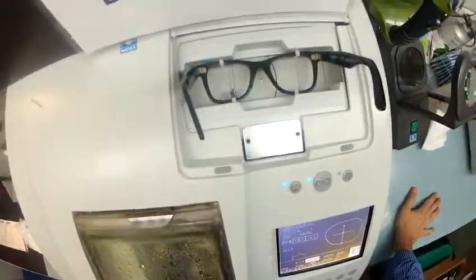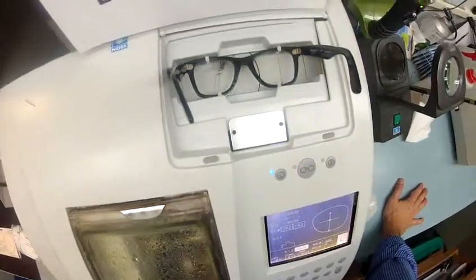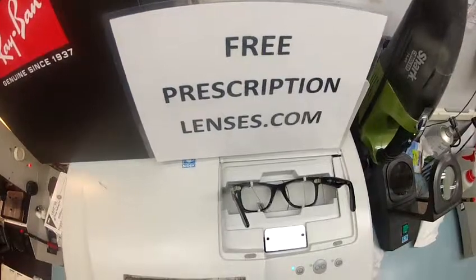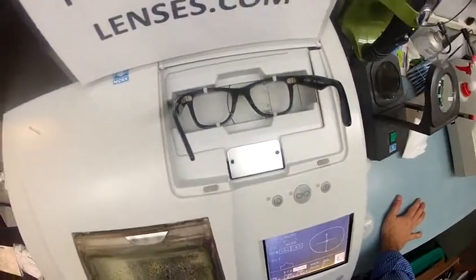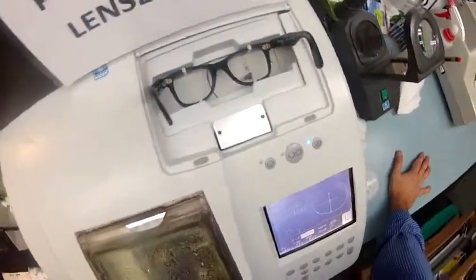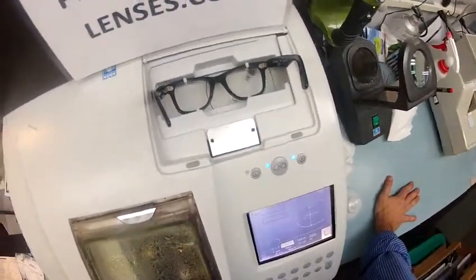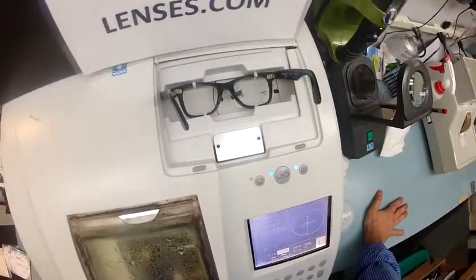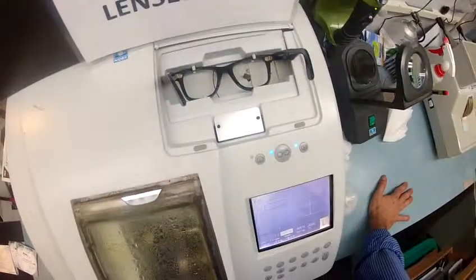The stylus is going to pop up and trace the shape of the left lens first, and then it's going to move over and trace the shape of the right. Here at freeprescriptionlenses.com, where everyone loves a bargain and no one is disappointed with quality — you buy the frame and you get free, clear, single-vision prescription lenses or non-prescription fashion lenses, which is what you chose, and then you pay the upgrade to have the transition photochromic gray lenses installed.